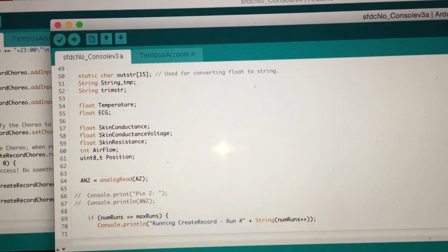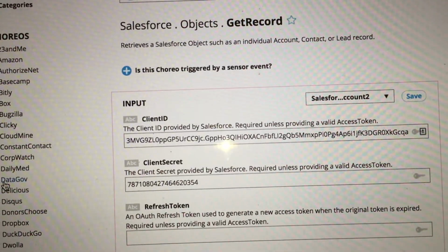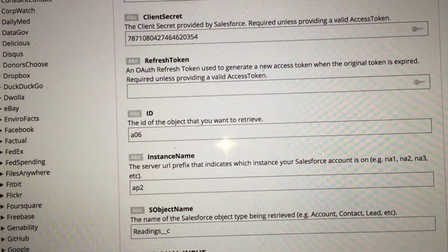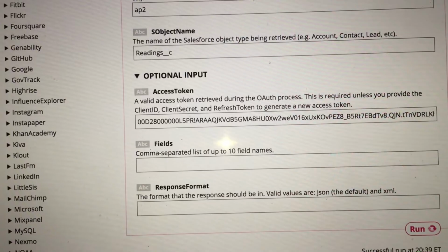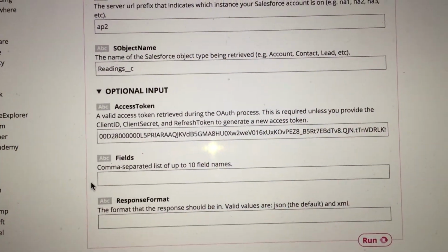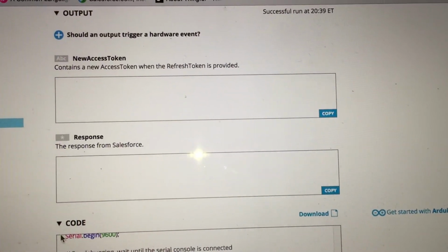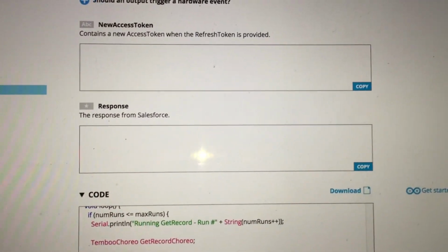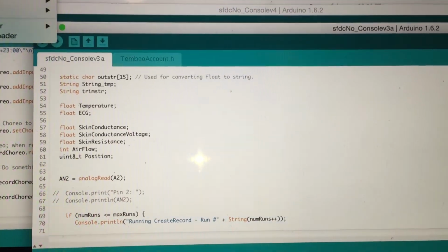Temboo is a website that I think one must explore because if you look at it, it's got multiple ways of connecting to different platforms, from Flickr to Google to Kiva to PayPal, of course, to Salesforce. And that's where I've picked up some amount of code that it creates, what it calls the choreos. It basically creates code you can cut and paste a fair bit of. But of course, you've got to do a bit of writing the code as well. So there you go. It's uploaded. Let's try and run it.